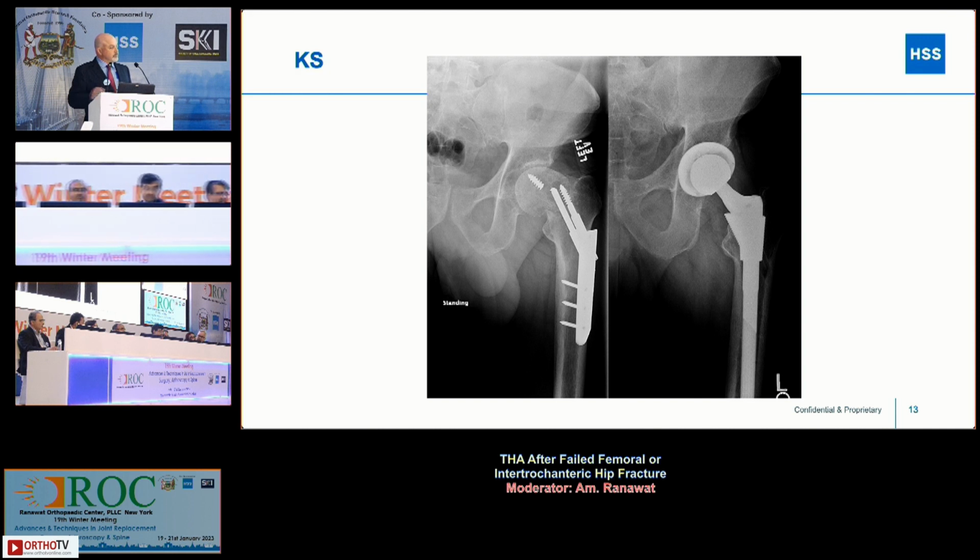Like I had one patient who was 25 years old, K nail. I broke 5 removers and I abandoned without even dislocating it because I knew it's not going to be easy. So without dislocating, I left it as it is and I said, we can't remove it, forget about it after 2 hours. If I had dislocated the hip first, I would have been in more trouble.